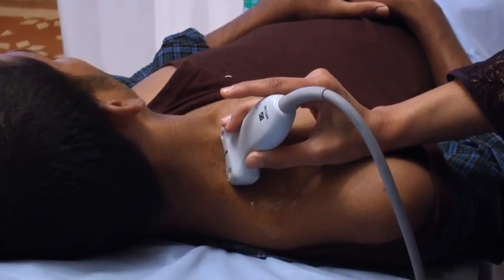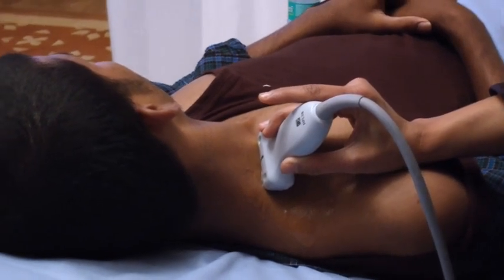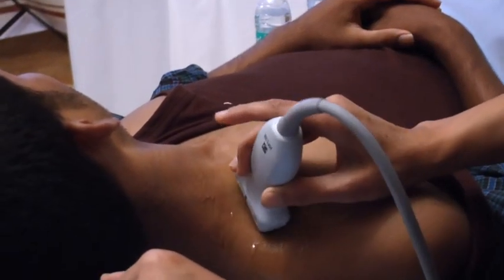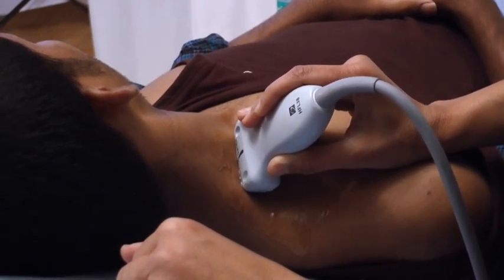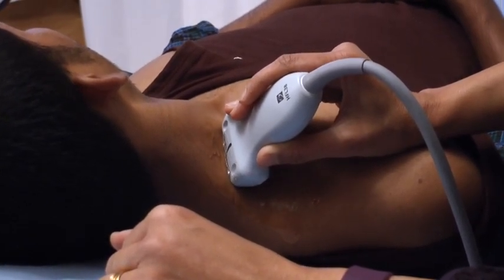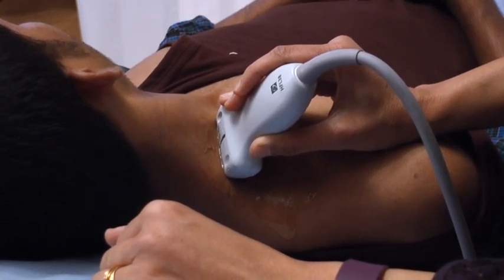vertebra. If you can increase the depth. So there you go. Okay, so there's the transverse process of one of the cervical vertebrae there.